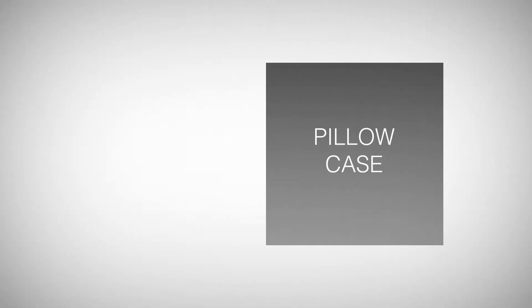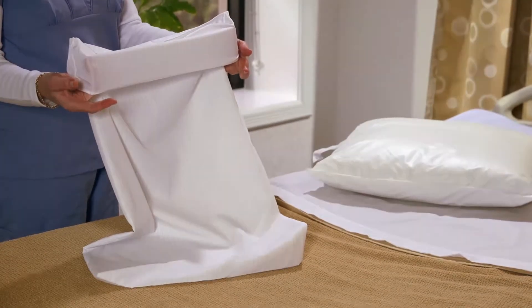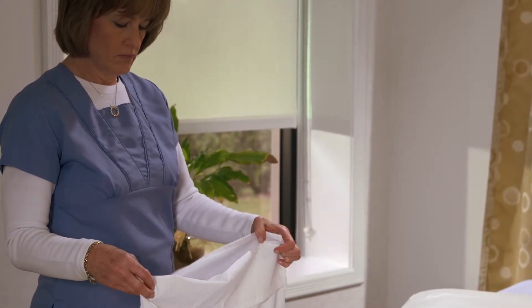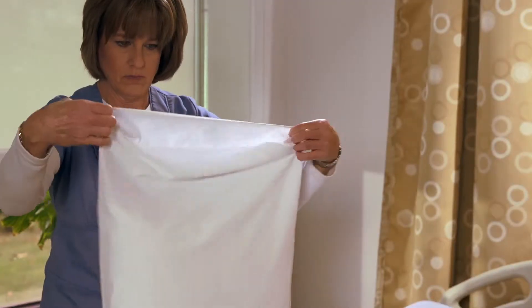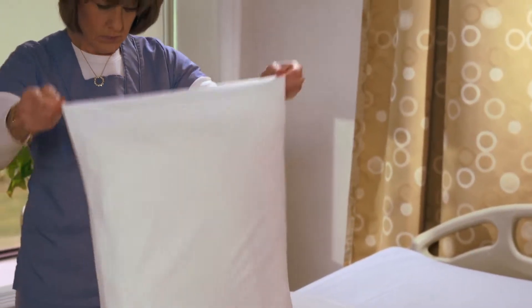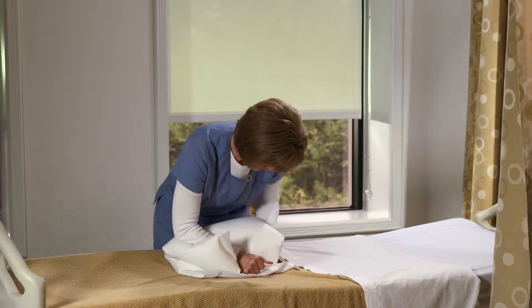Pillowcase. The pillowcase has a unique flap at the open end. It was created to prevent the smooth vinyl pillow from sliding out of the case. Once the pillow is in the case, fold the flap over to seal the pillow inside. The pillowcase can also be used to make a wedge for your patient. Double the pillow in half and tuck one end into the flap.